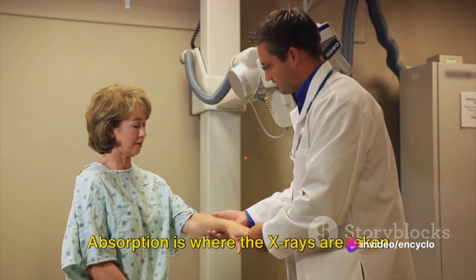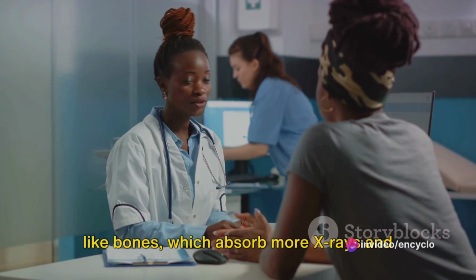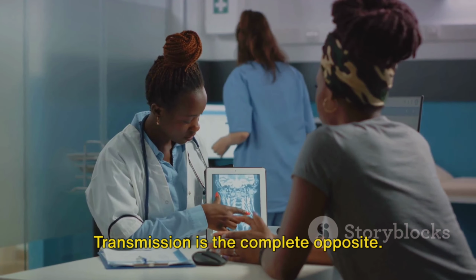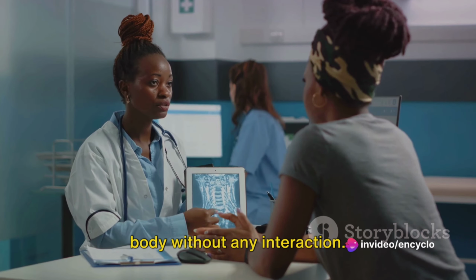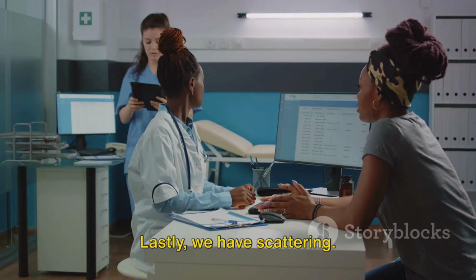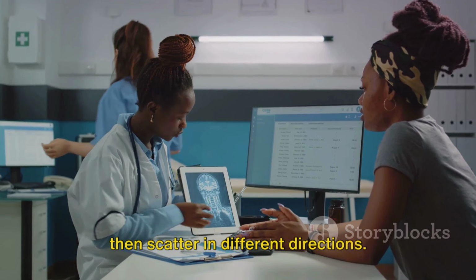Absorption is where the X-rays are taken up by the tissue. This often happens with denser tissues like bones, which absorb more X-rays and appear white on the final image. Transmission is the complete opposite. This is where the X-rays pass through the body without any interaction. It's like they're on a sightseeing tour, just passing through and enjoying the view. Lastly, we have scattering. This is where the X-rays hit a tissue and then scatter in different directions.